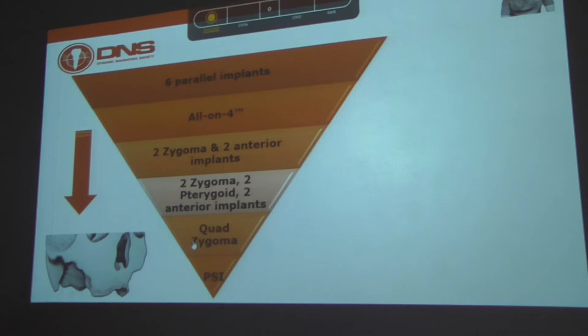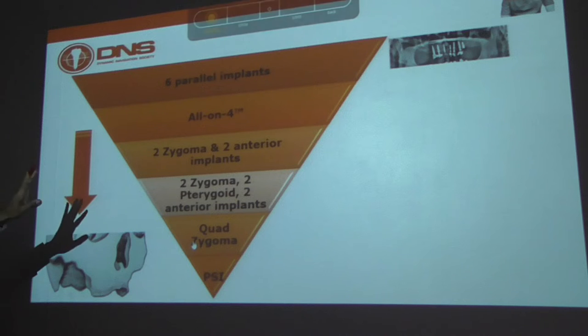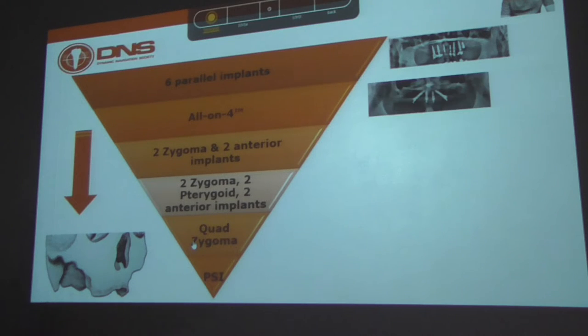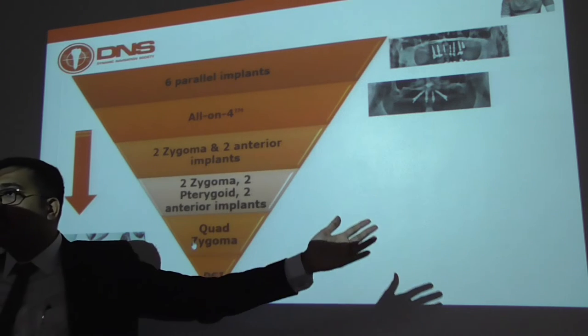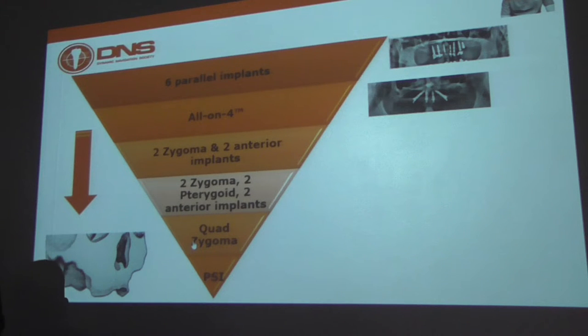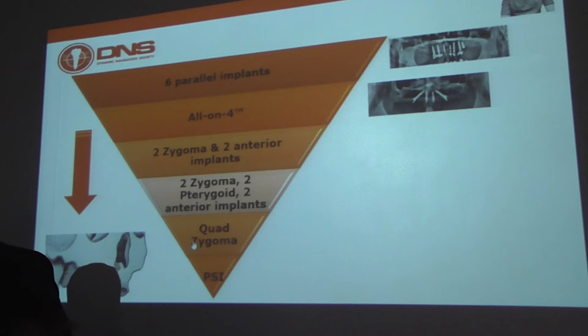I would treat a good patient with the maximum number of implants, 6, 8, depending on each one's protocol, parallel ones. In slightly lesser bone and lesser occlusal requirements, with no distal extension and opposing teeth not natural, so the opposing arch is restored, then probably all on four is a good option.